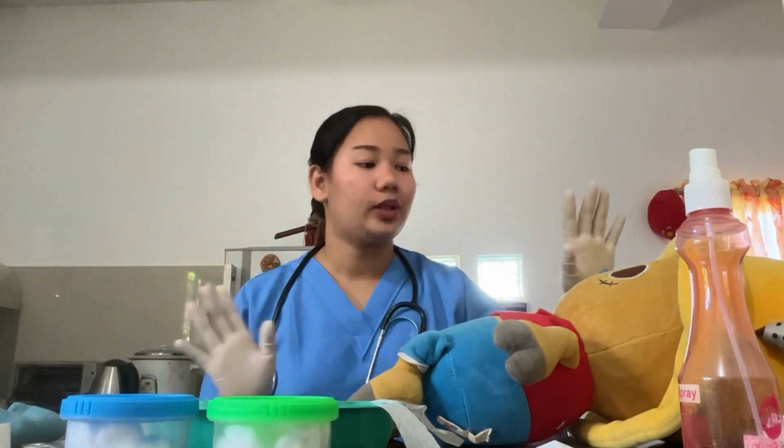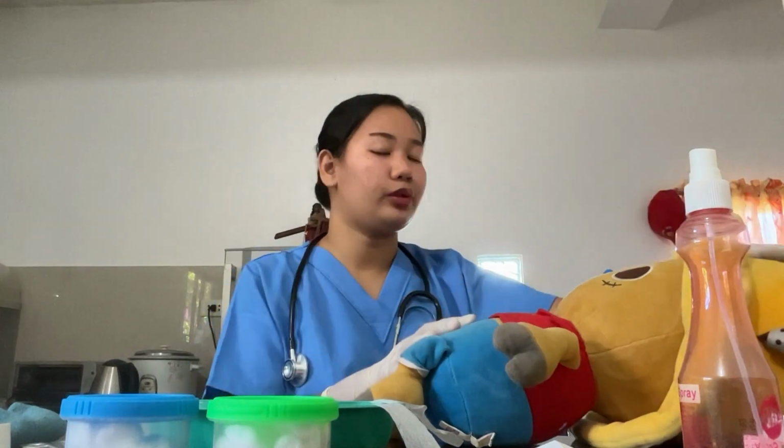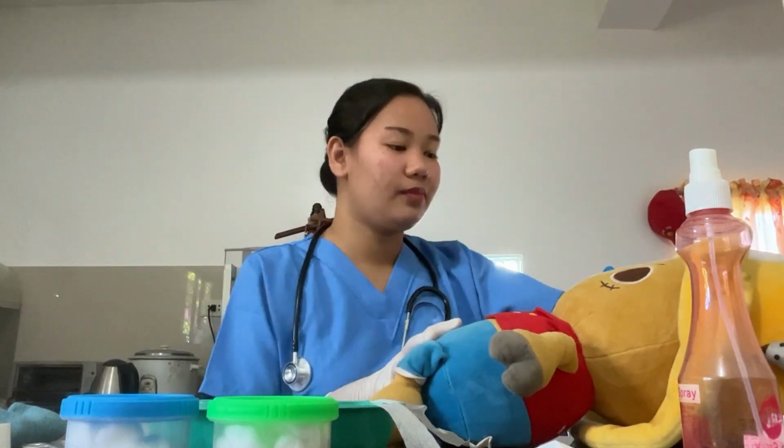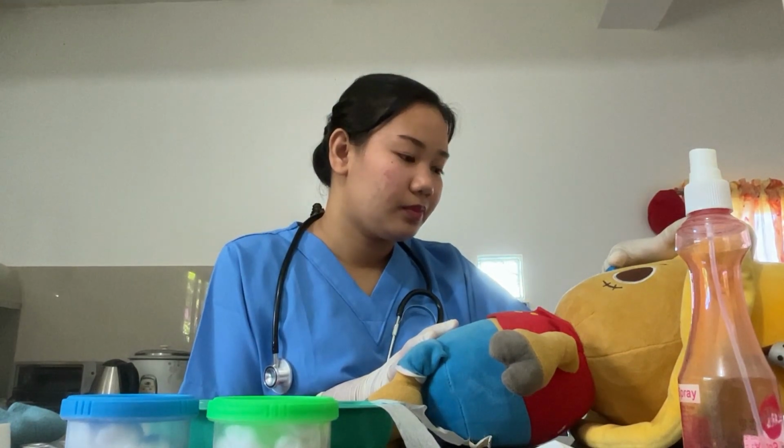to the room. And then after that, I am going to ask the patient to hyperextend her head to examine and observe the intactness of her nasal passages, and also to select which has the greater airflow. So I'm going to ask her to hyperextend her head and observe her nasal passages.